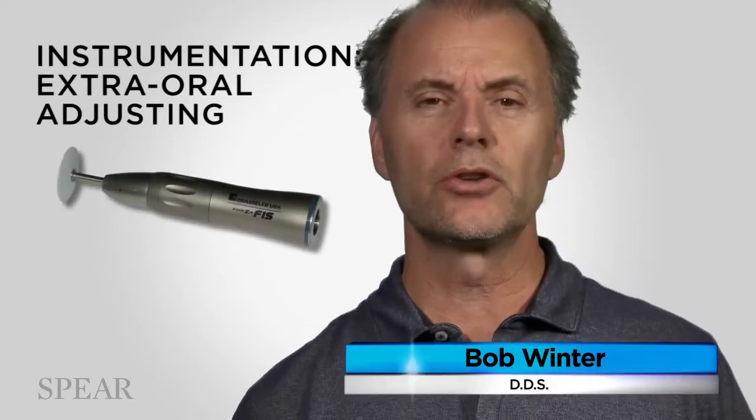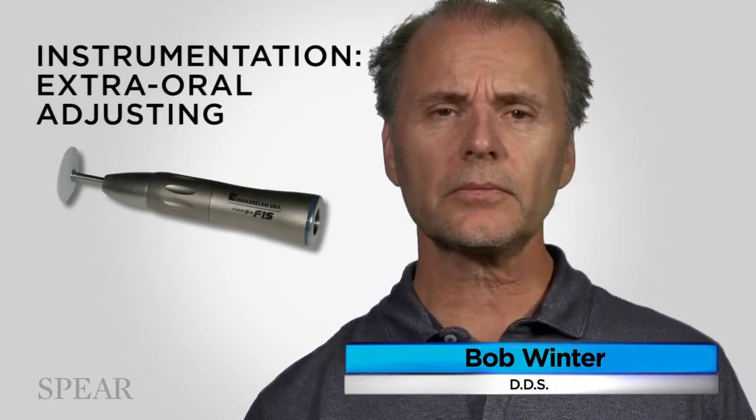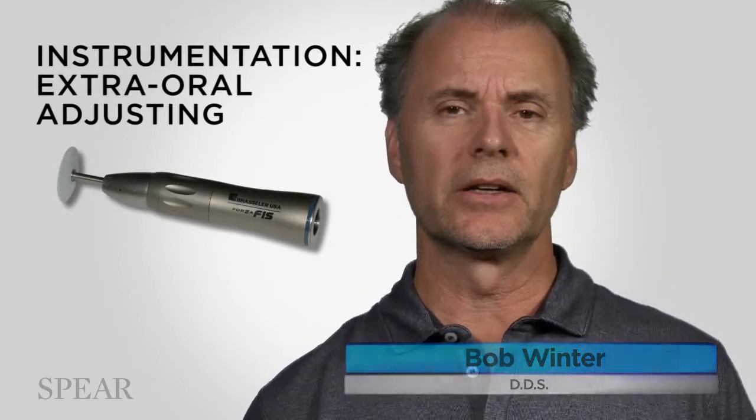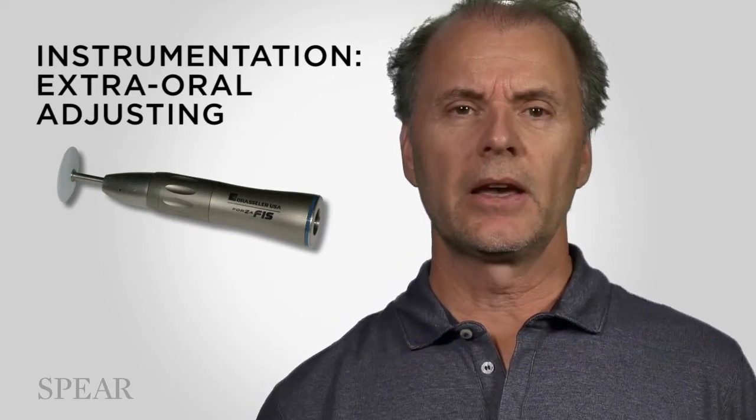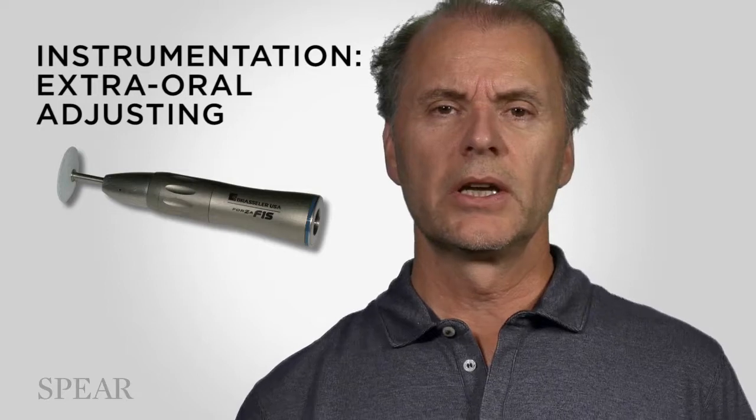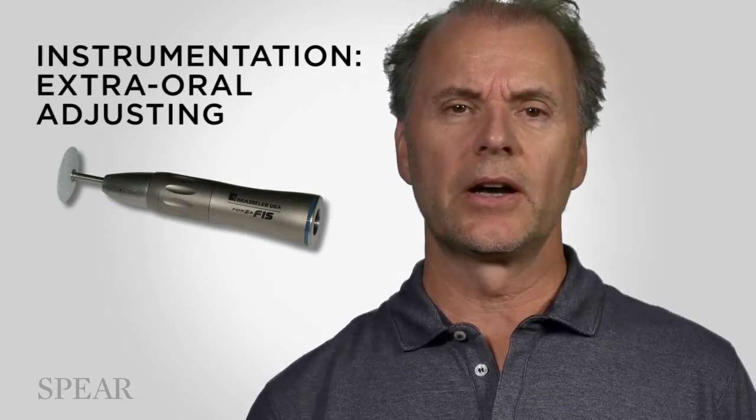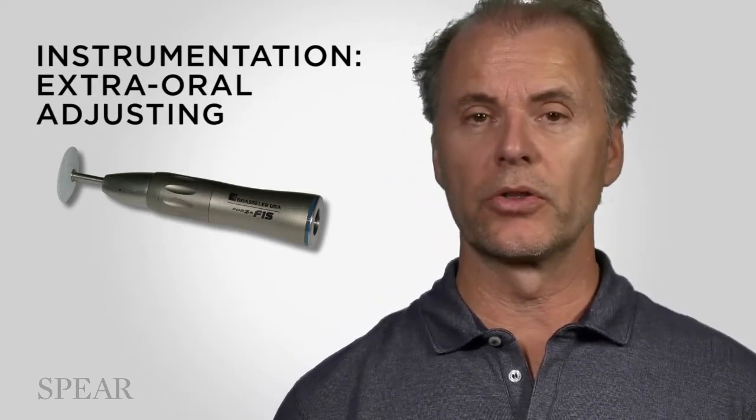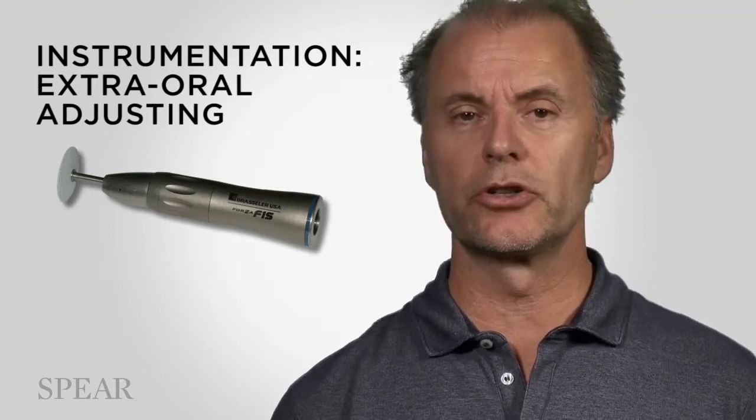So, instrumentation. I try and do as much as possible before I seat the restoration. And the key element for me to consider is the power or the handpiece that we use for the adjustment.